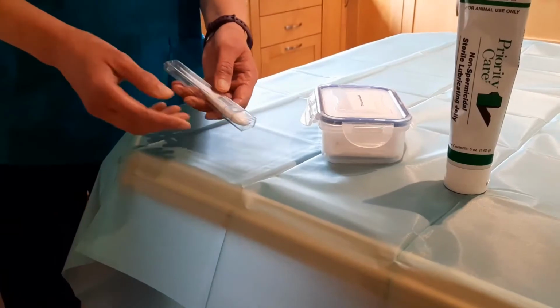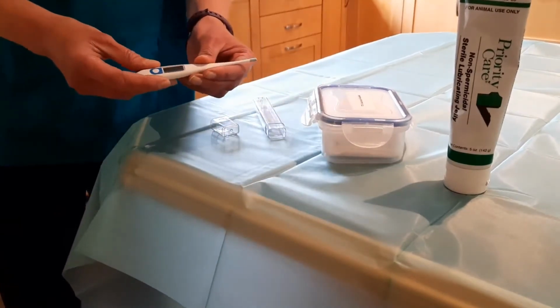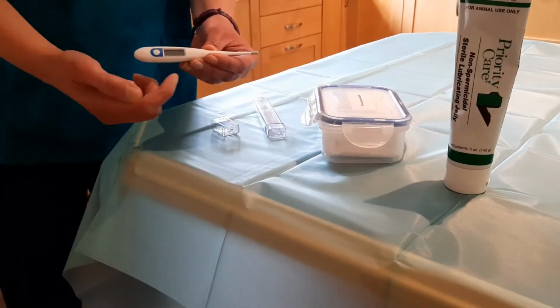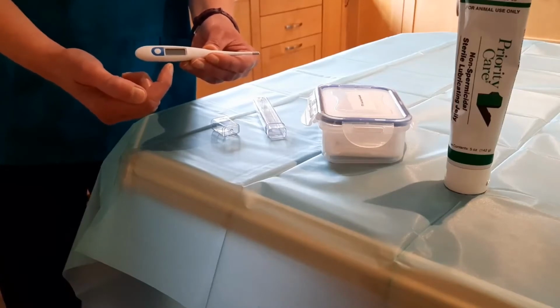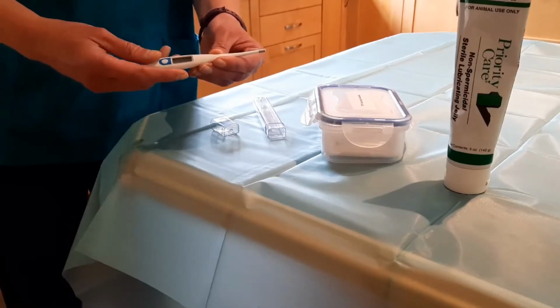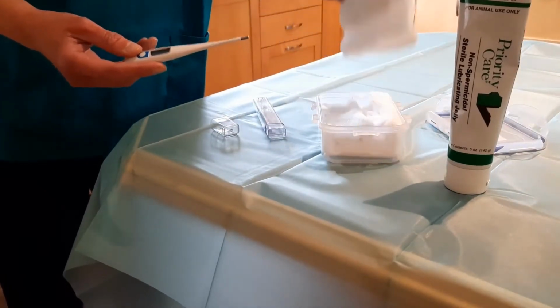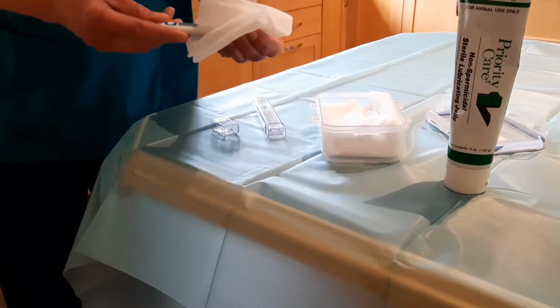This is a digital thermometer, and it's a good idea to always keep it in its original case. It's got a probe with a sensor here at the tip, an on-off switch, and an LCD display, which is where the patient's temperature will be shown. You should always clean and disinfect the thermometer before use. You can use disposable thermometer covers, though these aren't commonly used in veterinary practice.